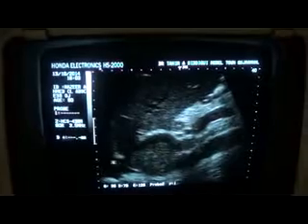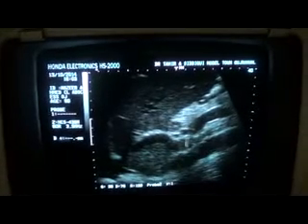This is the caudate lobe of the liver, and the IVC is coursing posterior to it.